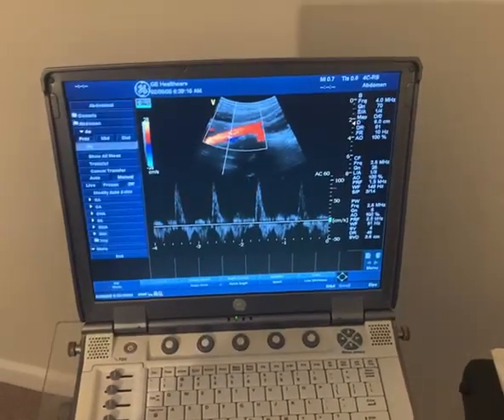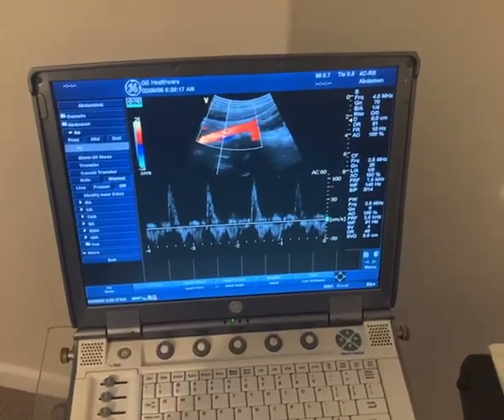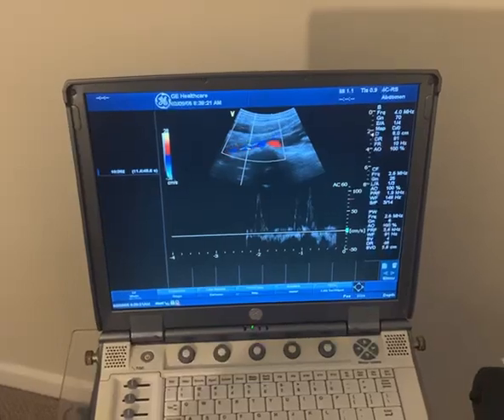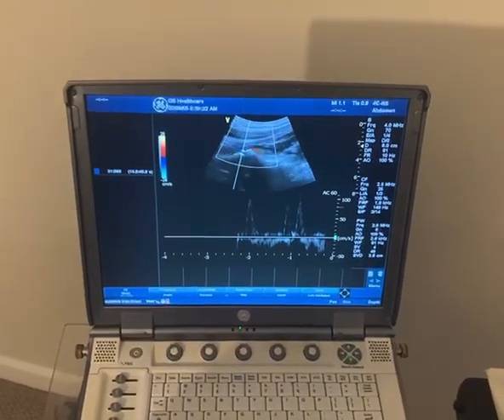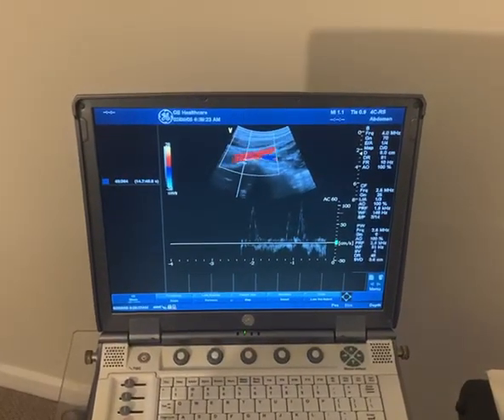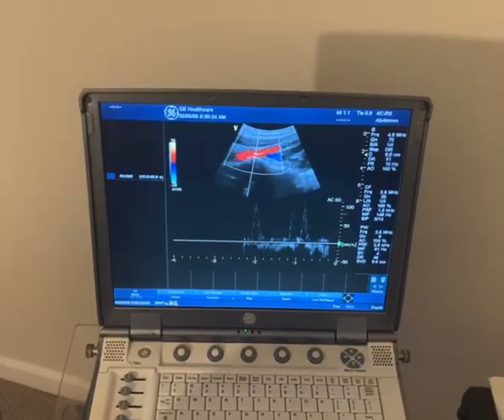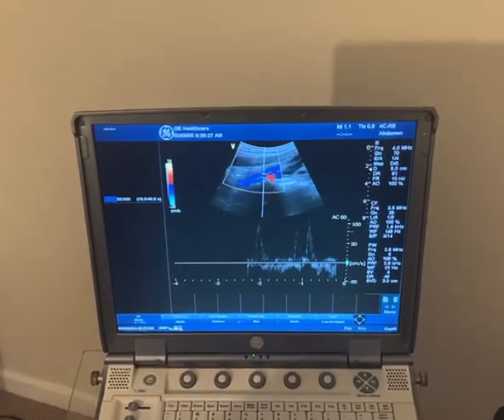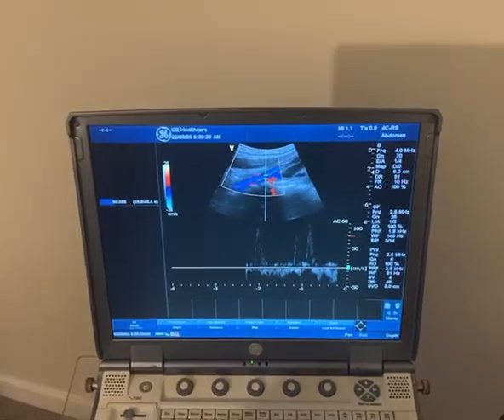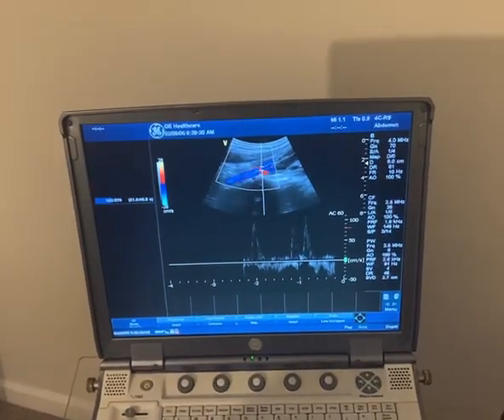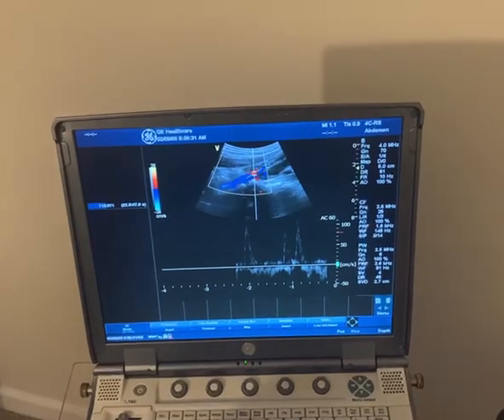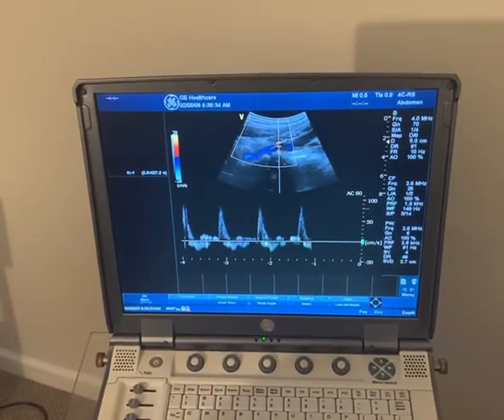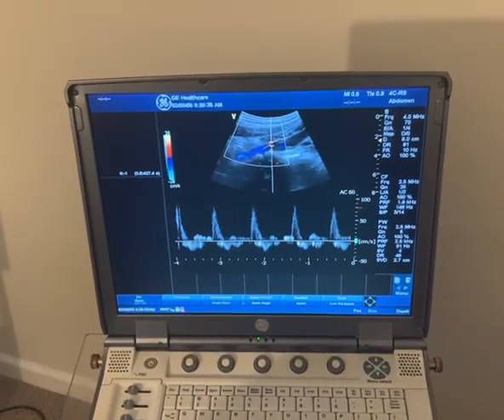I'm going to freeze that and then unfreeze again and update my image, slowly moving into the distal segment. I'm rocking my probe to try to keep it as parallel as possible as I image this vessel. That's the distal segment of my common iliac artery.